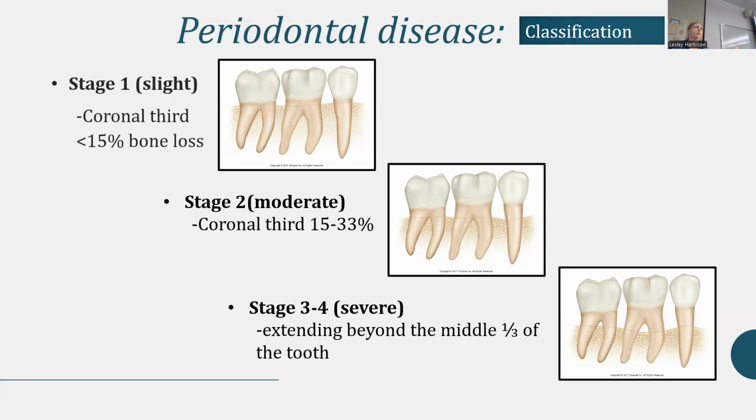I call it a trunk; I don't know if that's the term you learned, but that's what I was taught eons ago. The area before the furcation could be very short, so they could have a furcation involvement and still be in the coronal third. So it's not a hard line. There's that gray area, which is challenging, but in general I try to give you pictures where this staging makes sense. Just for your understanding, know that things are not cookie cutter. Everyone's anatomy is different.